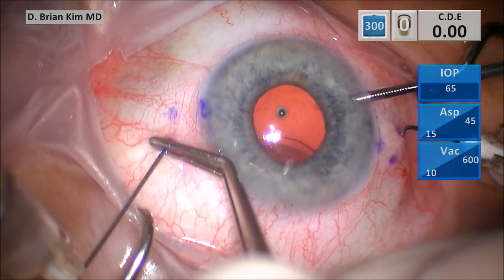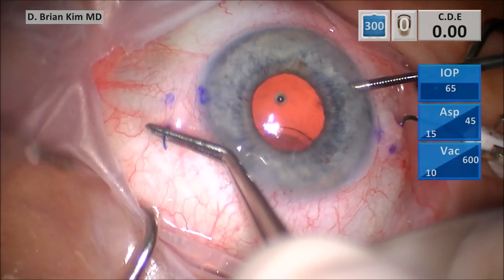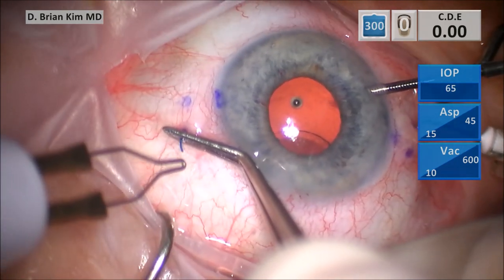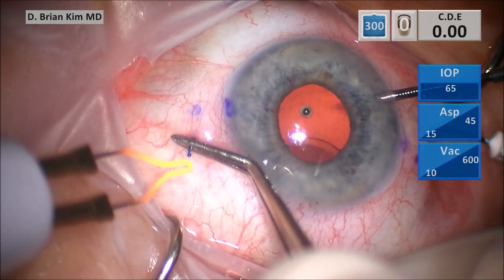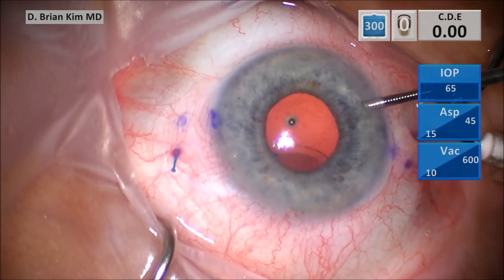And this stretching of the haptic will actually cause some deformation to the contour of that haptic. In fact, what it'll do is cause that left-sided haptic to be stretched so much that the haptic length will be longer on the left side relative to the right side. And this is what causes the decentration at the end of the case.